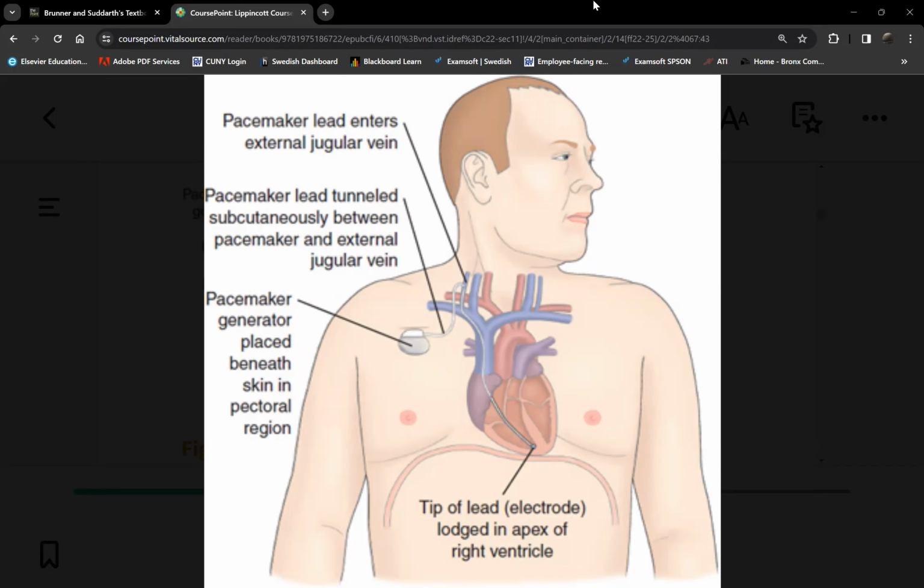So bacteria will make a house out of that foreign object. Okay, so do we want that? No. So in the meantime, the patient will receive a transvenous. The device is outside. However, the wires are inside. Will the electrodes get infected?